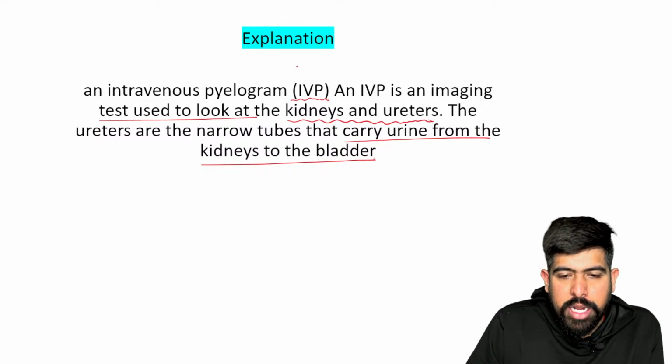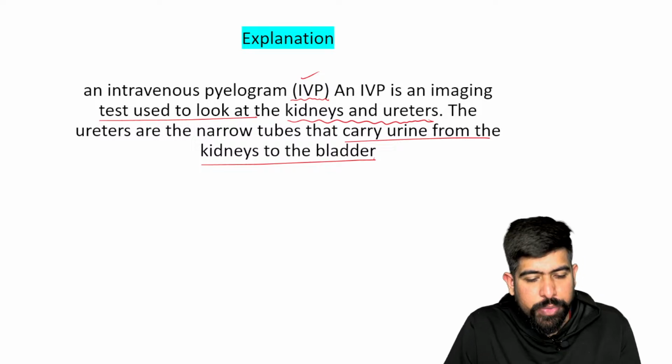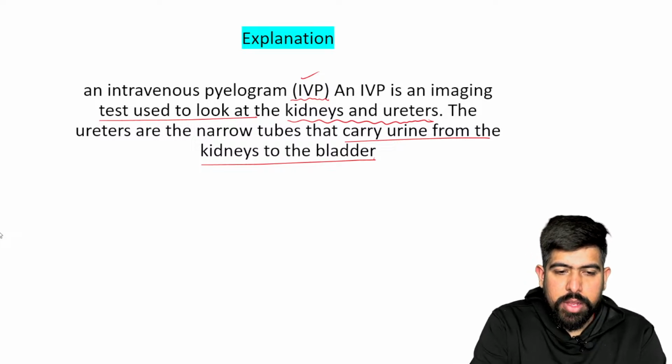Okay, so please remember about the IVP that this is the imaging test for looking at the kidney and the ureters. The ureters will be clearly visible to you. Is it okay, guys? Should we move forward? Very good.